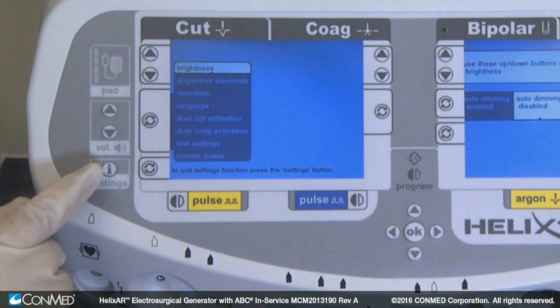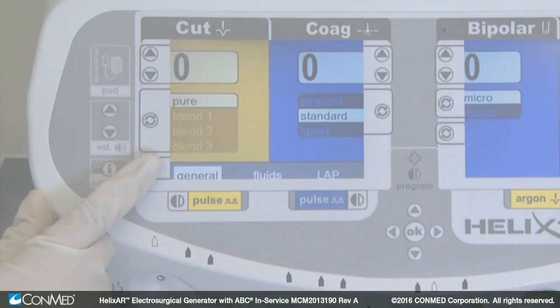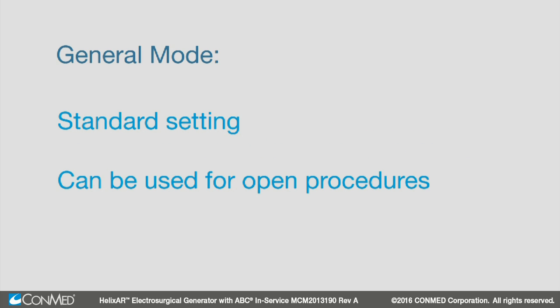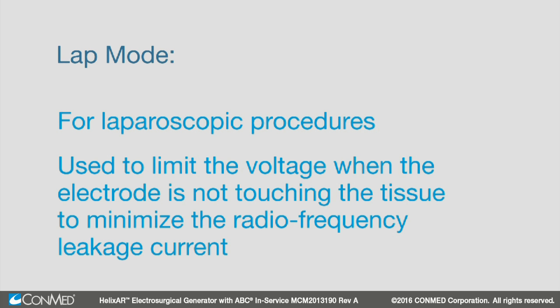This generator features specialty modes. The specialty mode selection key cycles through options for general, fluids, and laparoscopic mode. These pre-programmed modes establish a precise baseline of safe energy output. The general mode is a standard setting and can be used for open procedures. The fluids mode is used where fluid is present in the surgical field. The lap mode for laparoscopic procedures is used to limit the voltage when the electrode is not touching the tissue to minimize radiofrequency leakage current.